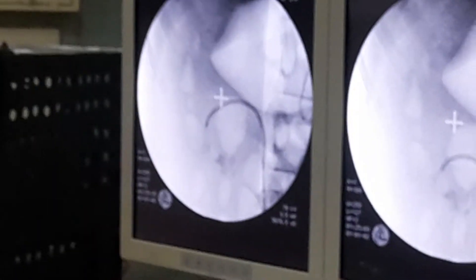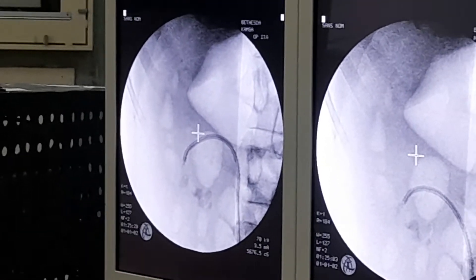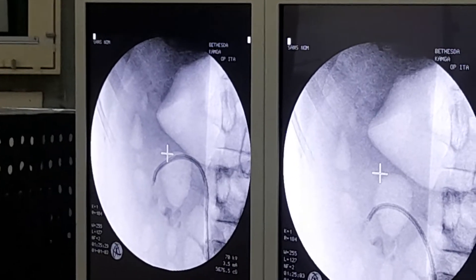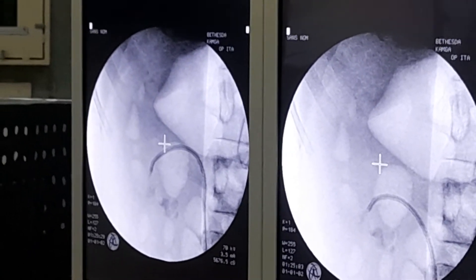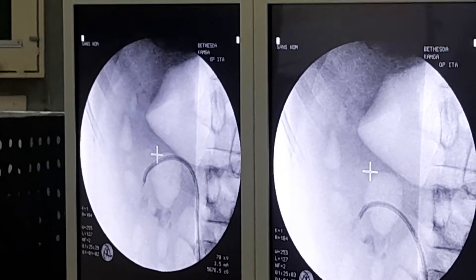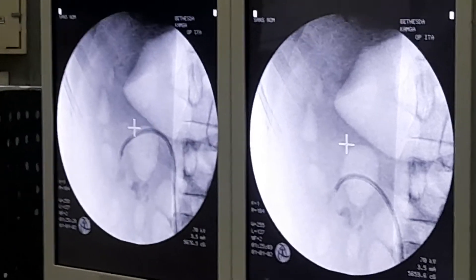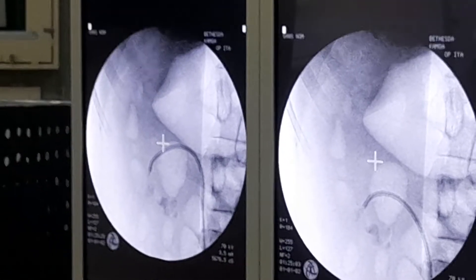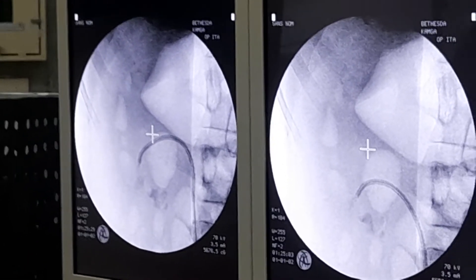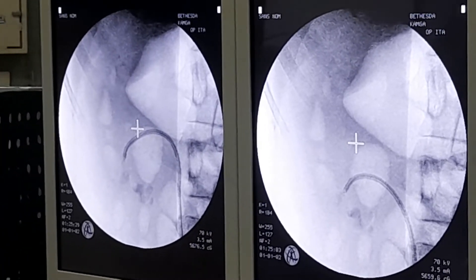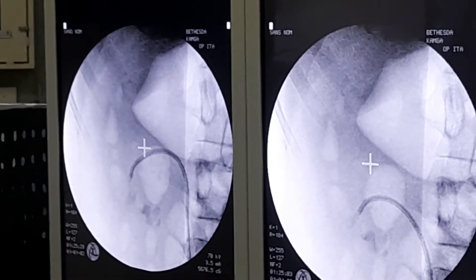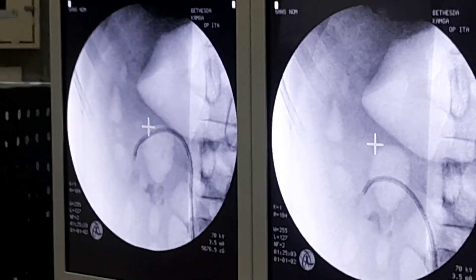This is actually the contrary of a normal radiography, where the bones — the radiopaque substances — are normally white. Here, in this case, it is the contrary: the radiopaque substances are dark, while the radiolucent substances are white. It depends only on the parameters of the shape.